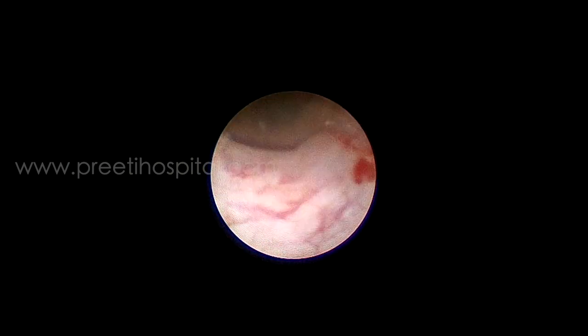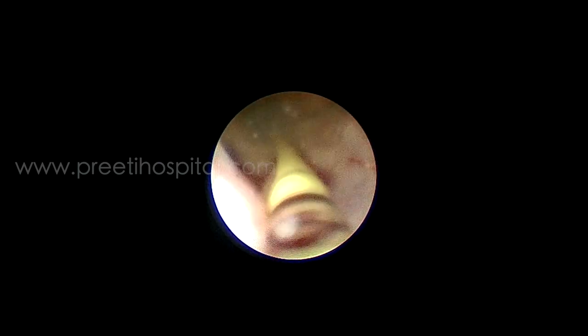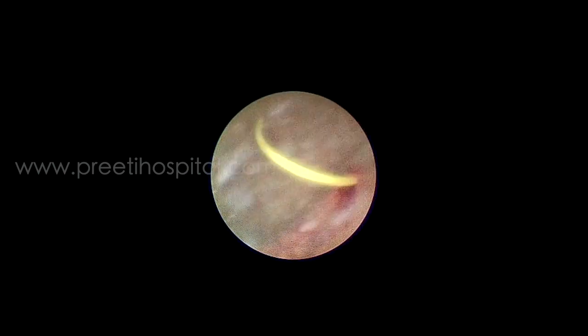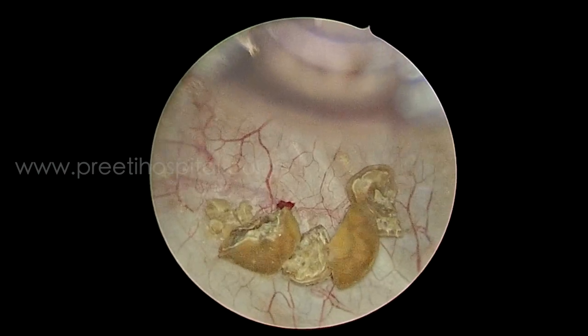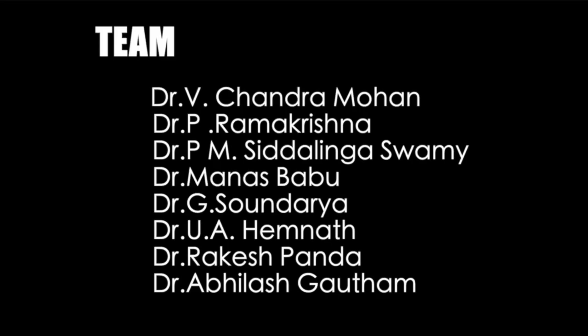Once it is done, a stent is inserted — we use a 3.5 French stent in general. The fragments from the bladder are then retrieved using a cystoscope sheath. These are some of the safe tips and tricks to be followed in a case of solitary kidney for ureteroscopic laser lithotripsy.